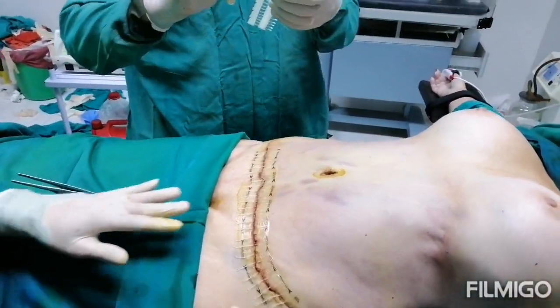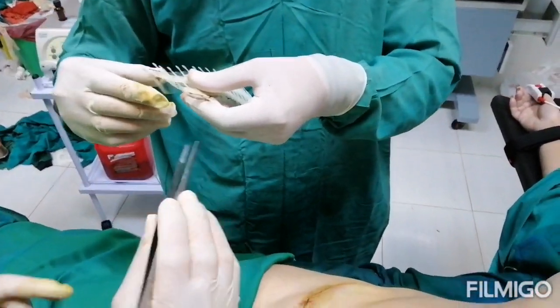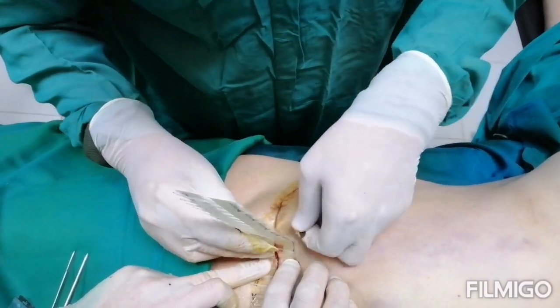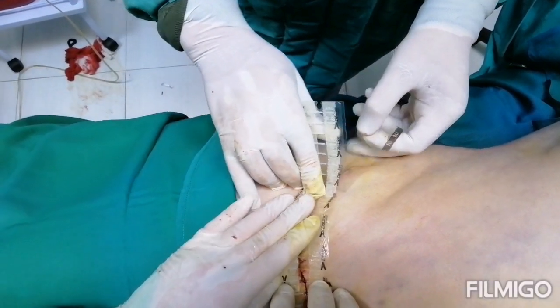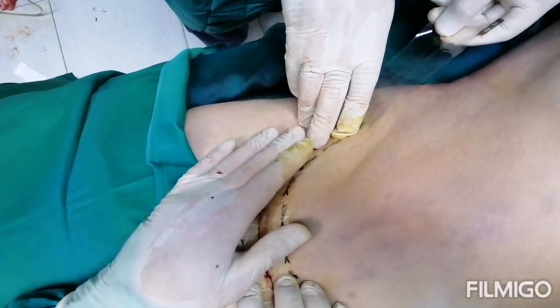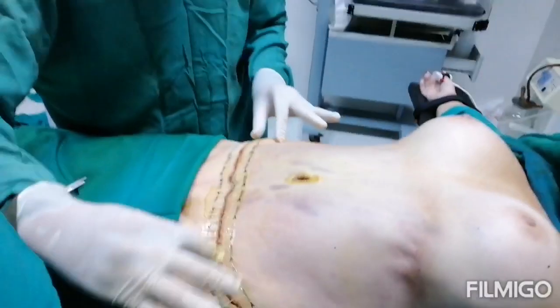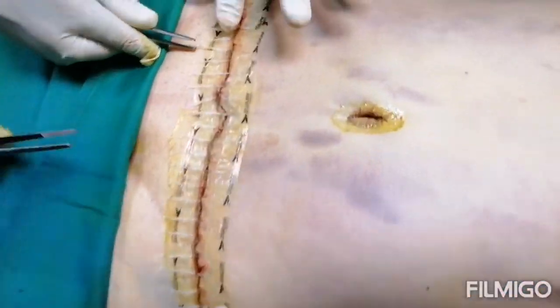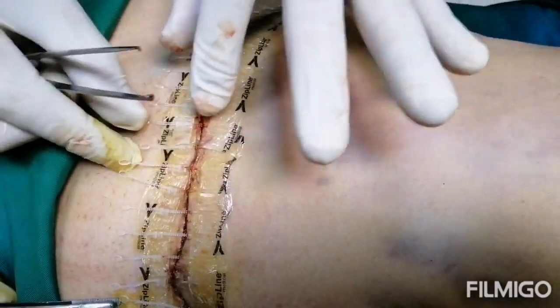First step is finished. We complete with another strip — a smaller one, same as this one. Then we continue. Now we fix the zip line. The idea of the zip line is two strips sticking on each side. We are showing how we close the wound by pulling the zip lines step by step like this — approximating the wound and pulling both sides together.